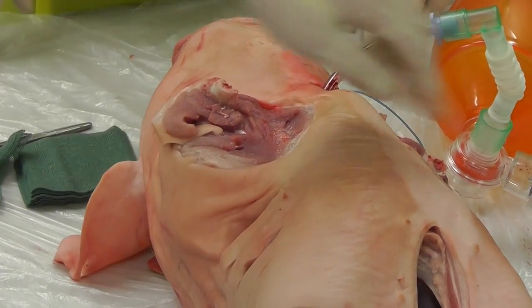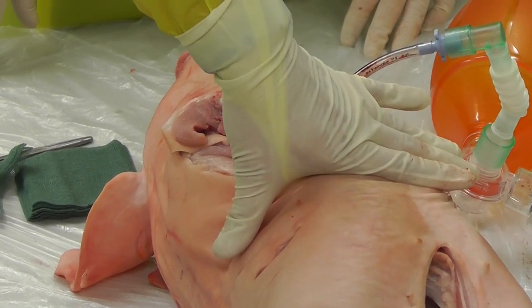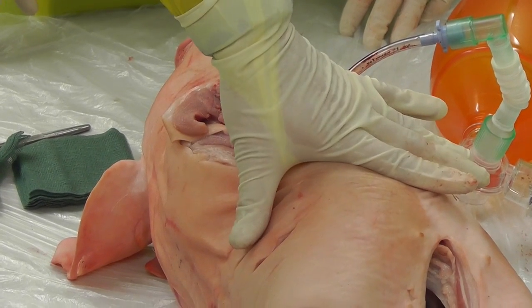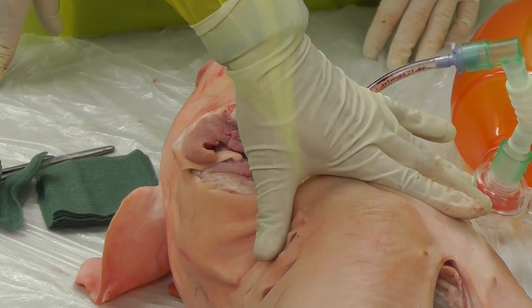If you have been able to get your finger thoracostomies at the same level by marking it out together as a team, then when you reach the sternum you are going to be at the same level, and that is fine. If you are one joint space across, it means your sternal division is going to be at a bit of an angle.